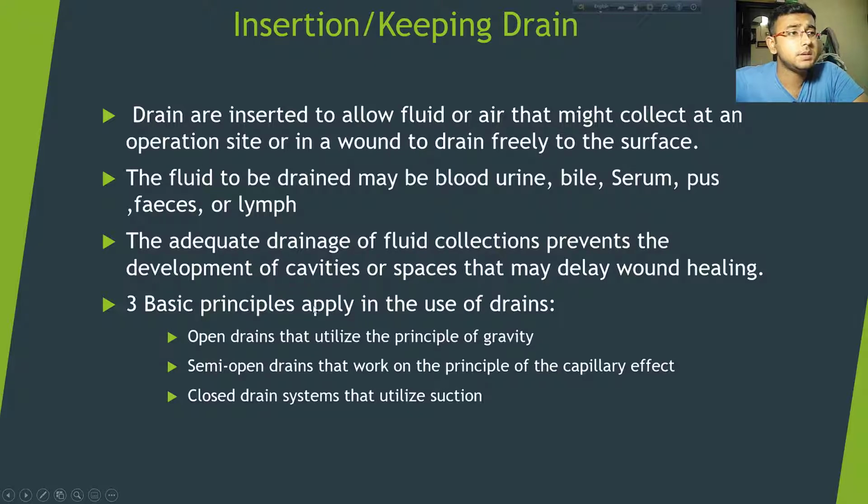So there are 3 basic principles applying to the use of a drain. One, drains that utilize the principle of gravity. So you place the drain along the gravity. Two, the semi-open drain that works on the principle of the capillary effect, so your drain will be semi-open. And three, the closed drain system is used for suction.